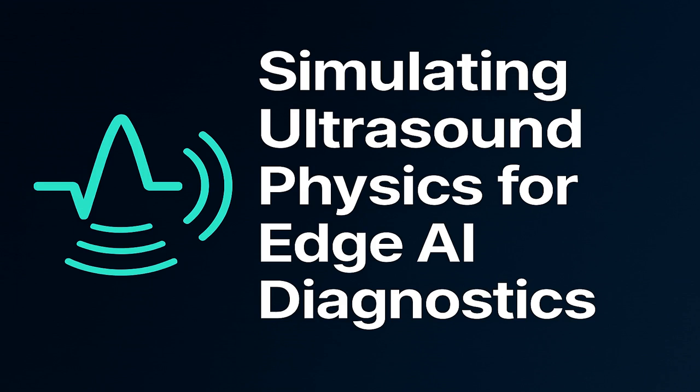It's inescapable. Absolutely. And in the decibel scale, which is how we track these losses in signal processing, that decay translates to a loss that's proportional to 20 log r. So just traveling from 1 centimeter to 2 centimeters causes a 6 dB loss just because of the geometry. It has nothing to do with what tissue it's passing through. Exactly. It's distance dependent, not frequency dependent.